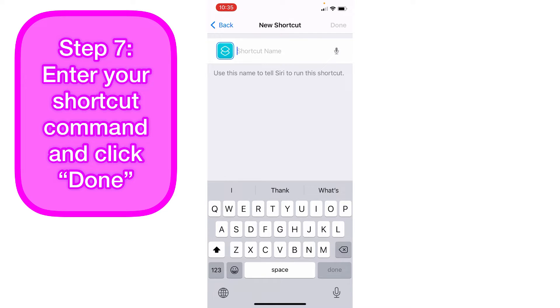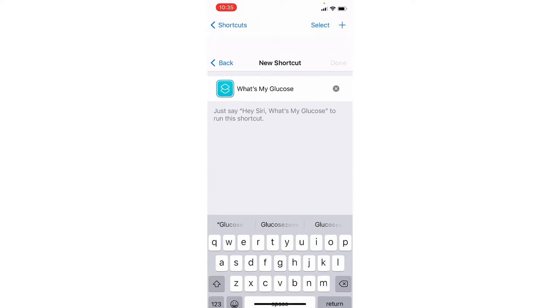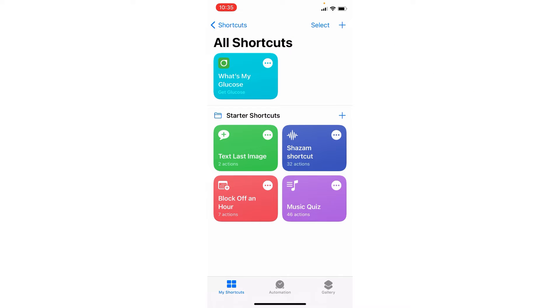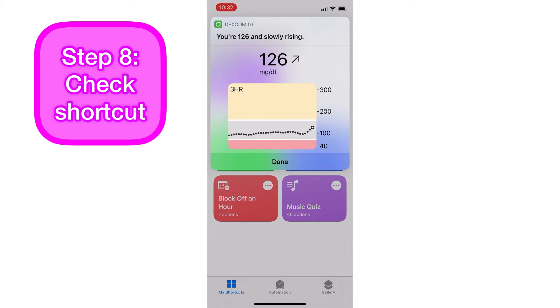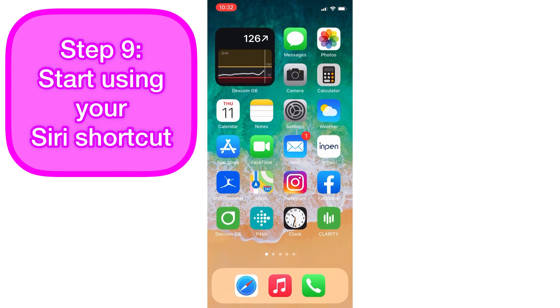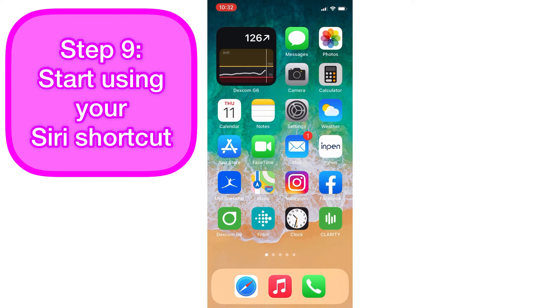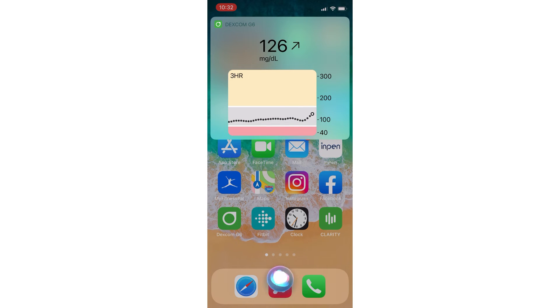Now type in what you want the command to be — I want mine to be 'What's my glucose,' so that's what I'll type. Click Done, and then check that it works by clicking on the shortcut. The check mark came up and it's reading my glucose. Let's actually try the shortcut — hey Siri, what's my glucose? Okay, viewing, you're 126 and slowly rising.